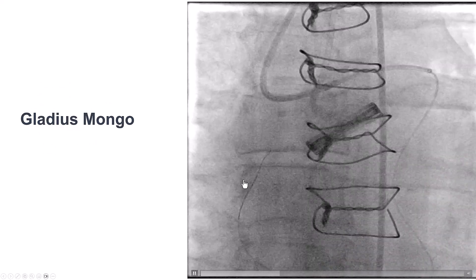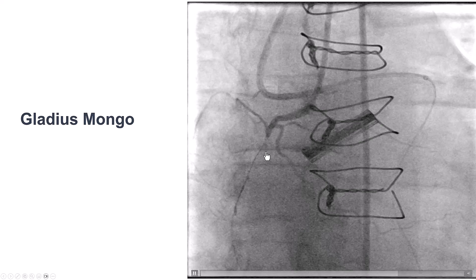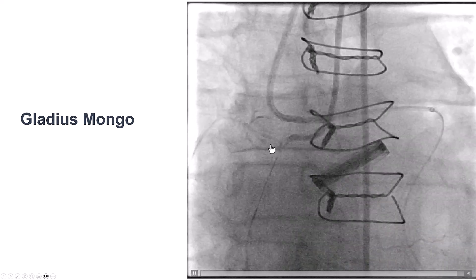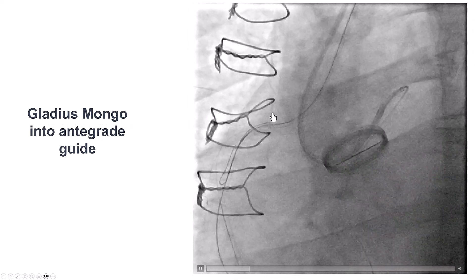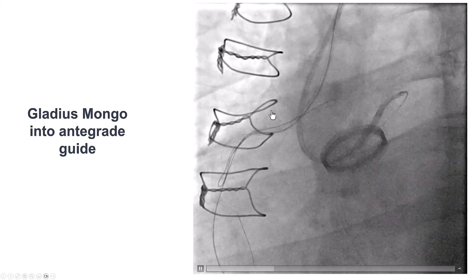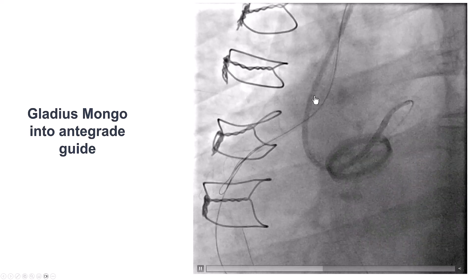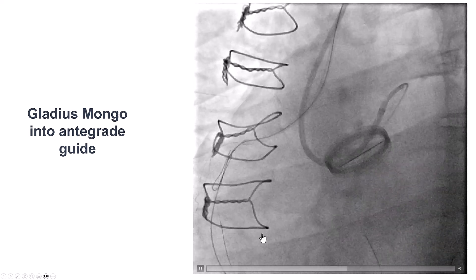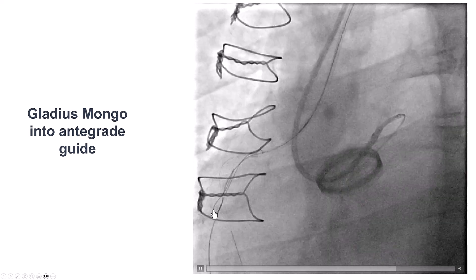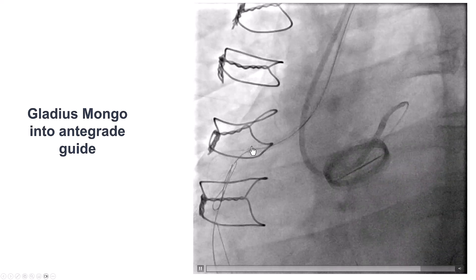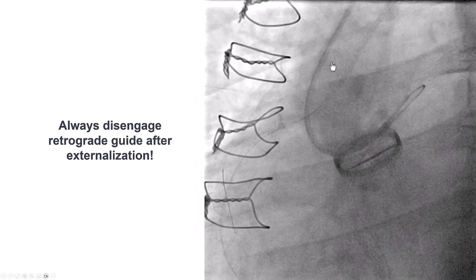Now we're well-positioned for crossing the CTO. This is a retrograde Gladius Mongo guide wire that is advanced, very close to the proximal cap. We were able to cross retrograde true-to-true into the antegrade guide catheter, which significantly facilitates externalizing a guide wire and treating the CTO. For relatively short CTOs, true-to-true crossing from the distal true lumen to the proximal true lumen can be feasible, and with multiple attempts one may be able to advance the guide wire into the antegrade guide catheter.